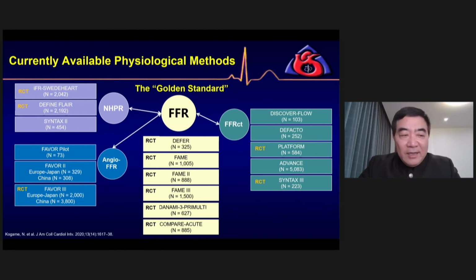Recently, dozens of FFR surrogates have been developed, such as QFR, I think developed in China, and iFR, CAFFR, CAIMR, RFR, etc. However, these FFRs are surrogates of myocardial ischemia by assessing the luminal narrowing of the epicardial coronary vessel without any information on the microvasculature or microvascular dysfunction.